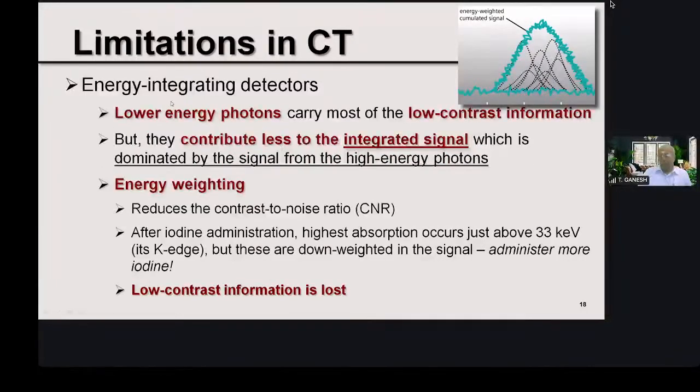The problem number two is that we are interested in lower energy photons because lower energy photons carry most of the information, the low contrast information. While doing CT, we want to differentiate between low contrast materials like soft tissues.